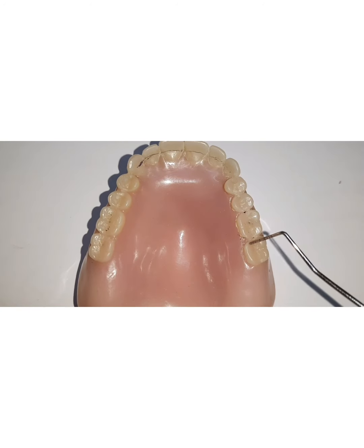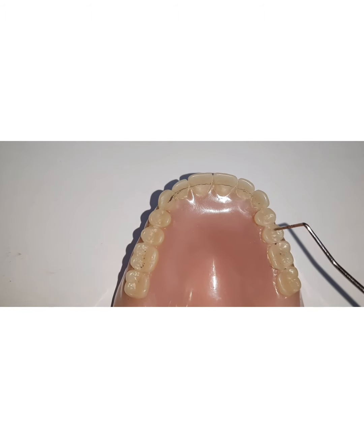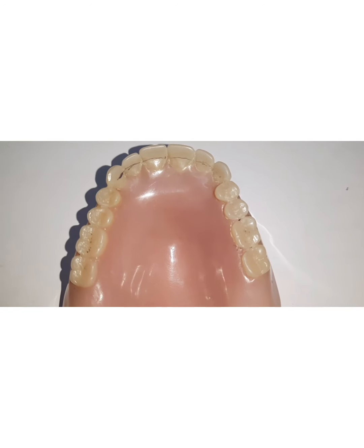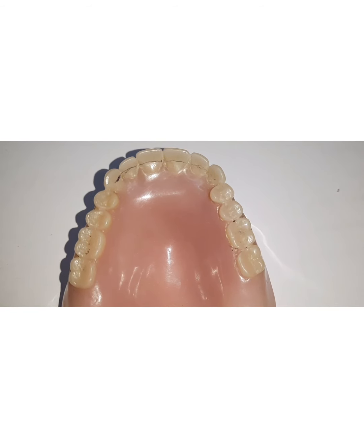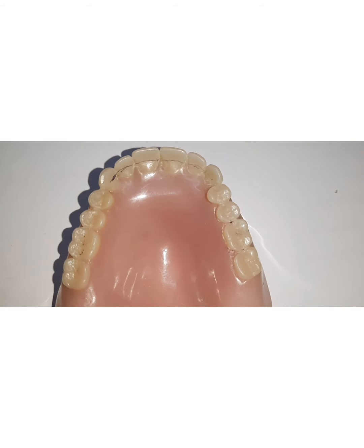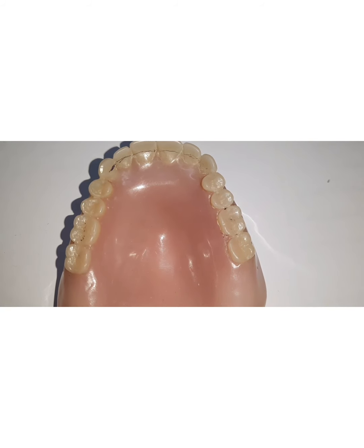We make amalgam stops here and place amalgam in them. Why amalgam? Because it has superior strength. It has better wear resistance in comparison to acrylic resin, and it is simple and less expensive than the gold occlusals. So you can also use acrylic resin with amalgam stops.